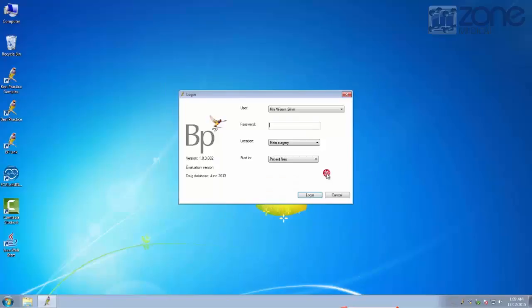You can then log in to Best Practice with your username and password, and you can choose a location.